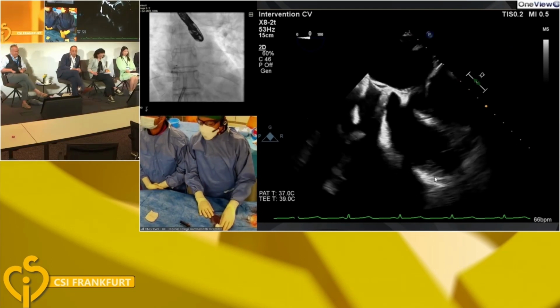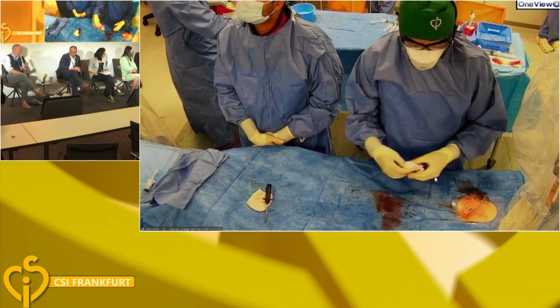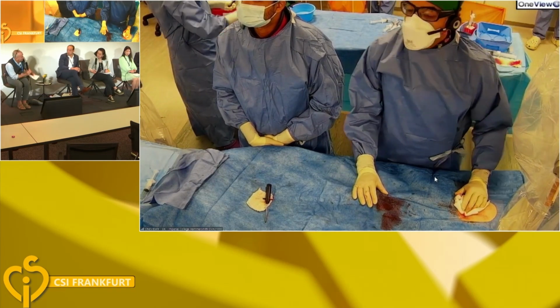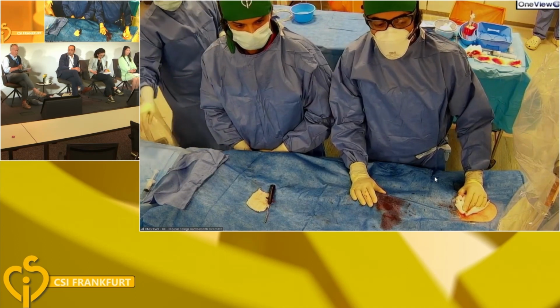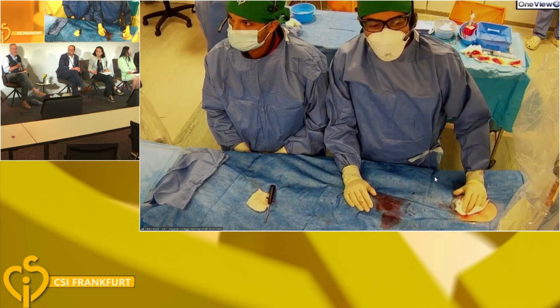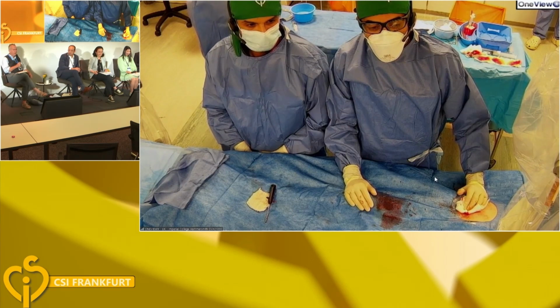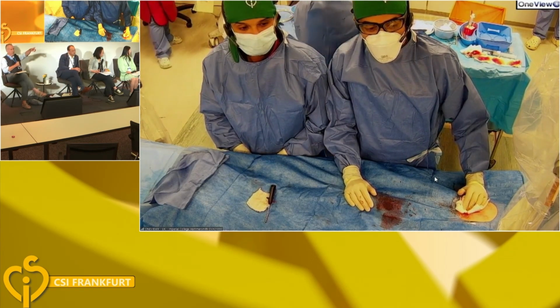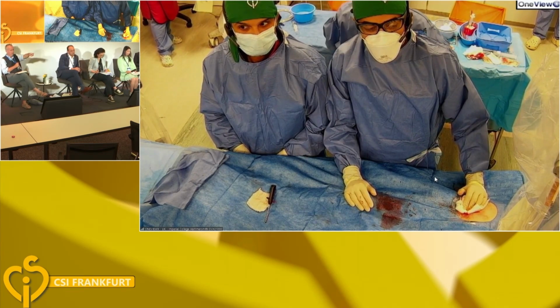Thank you. Actually, I didn't hear about that. In this procedure, is it general anesthesia or just sedation? So we use general anesthetic with TOE guidance for almost all of our cases. I'll make a comment that only a German patient can tolerate a TOE for this long without a general anesthetic. No English patient would tolerate that. Yeah, because in the manipulation, the very simple and petty complication is air embolism under sedation. So that is one of the very important points.